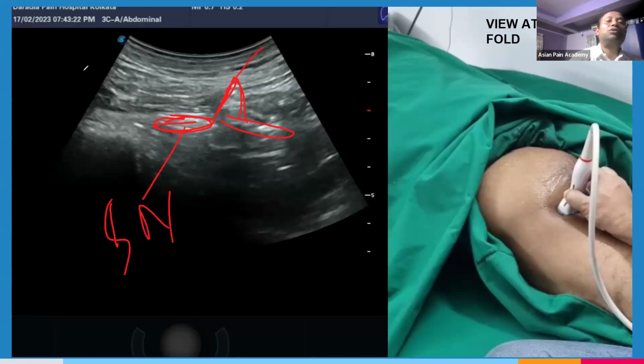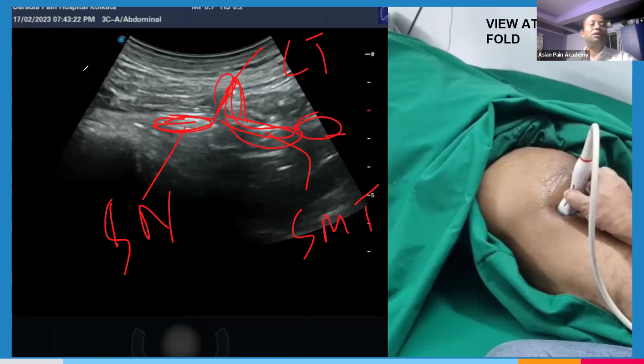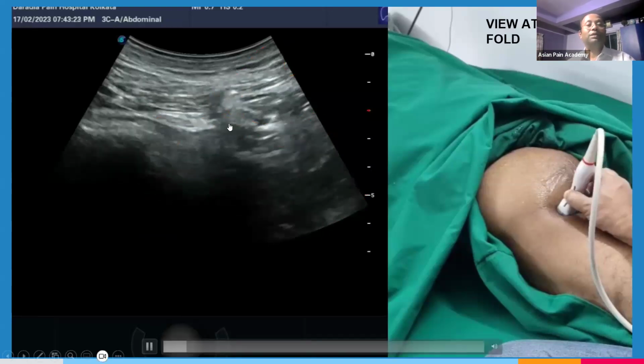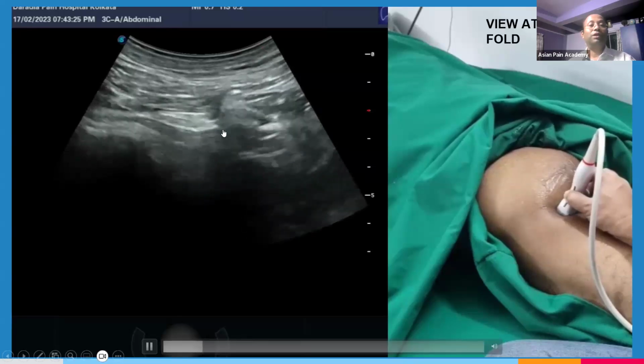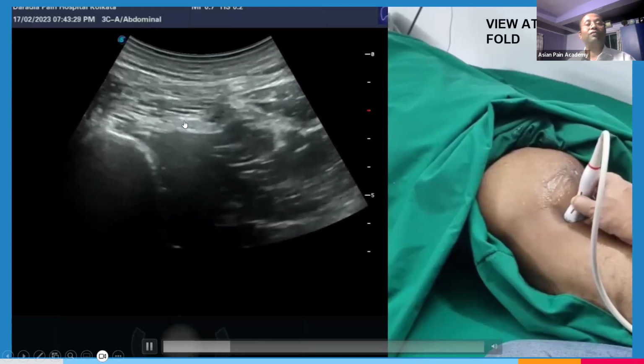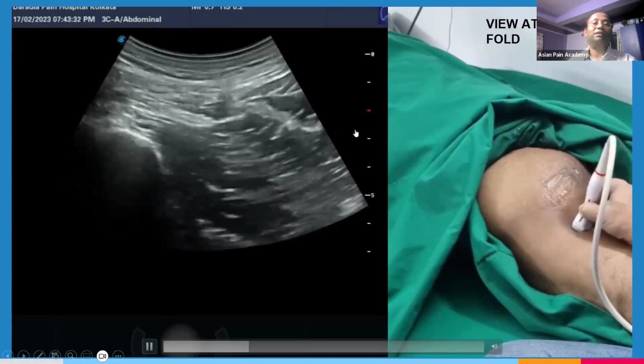This one is the conjoint tendon. And this side, there is the semimembranosus tendon. Of course, this total part is actually the conjoint tendon. The semimembranosus tendon is here actually. This is not part of your Mercedes-Benz sign, but still you can see. This is the conjoint tendon. This is the sciatic nerve. So at the gluteal fold, finding the sciatic nerve is very easy.